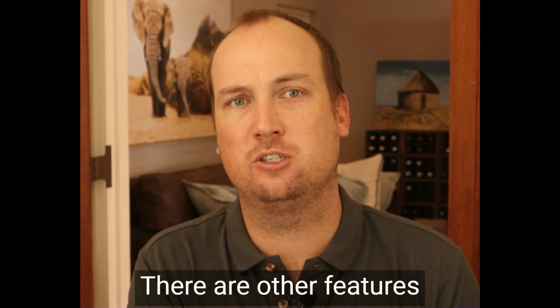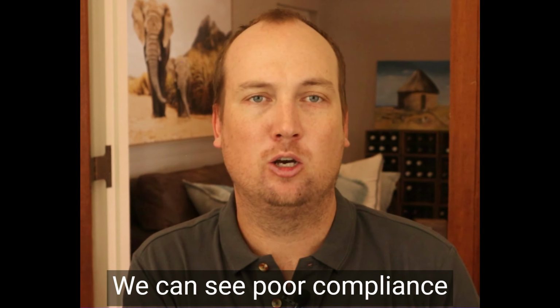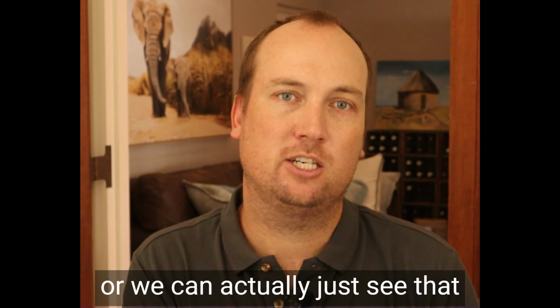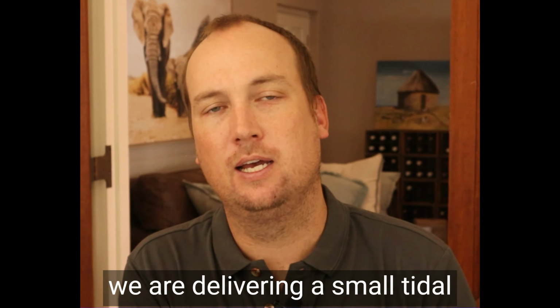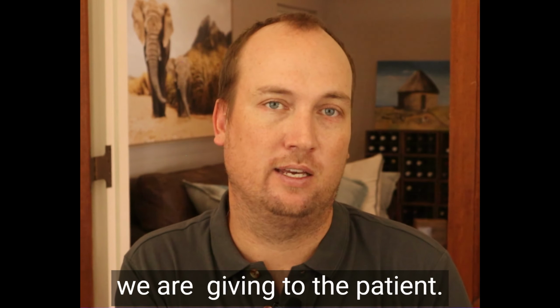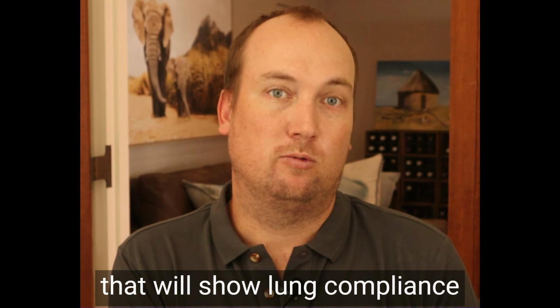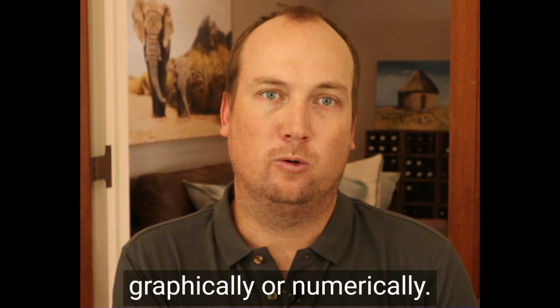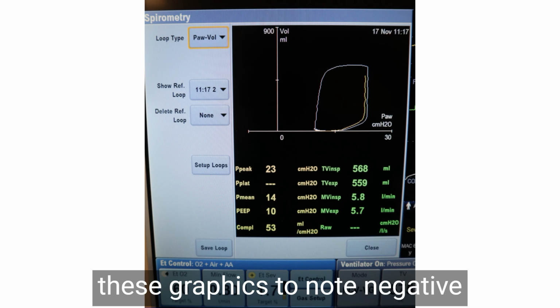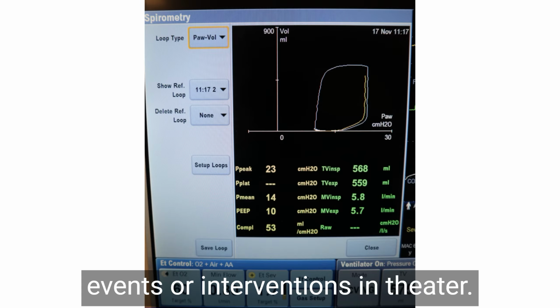There are other features of atelectasis too on our ventilator graphics. We can see poor compliance on our compliance waveform, or we can actually just see that we are delivering a small tidal volume for the pressure that we are giving to the patient. Many anesthetic workstations now have ventilator graphics that will show lung compliance graphically or numerically. And it's also possible to watch these graphics to note negative or positive changes during events or interventions in theatre.